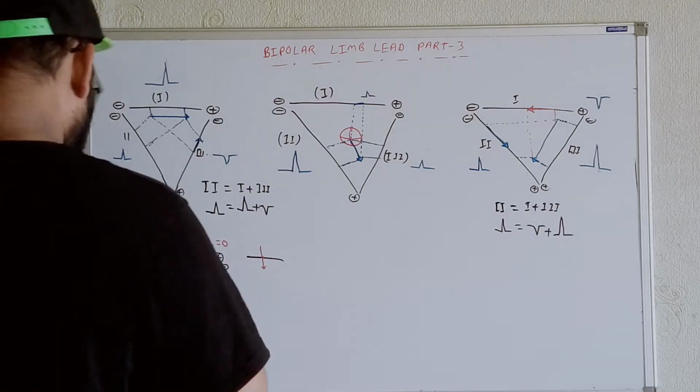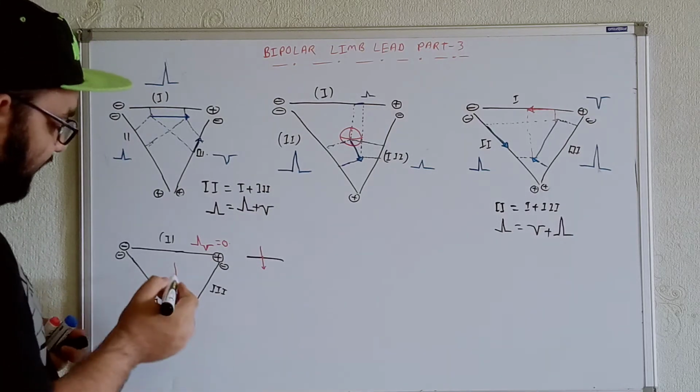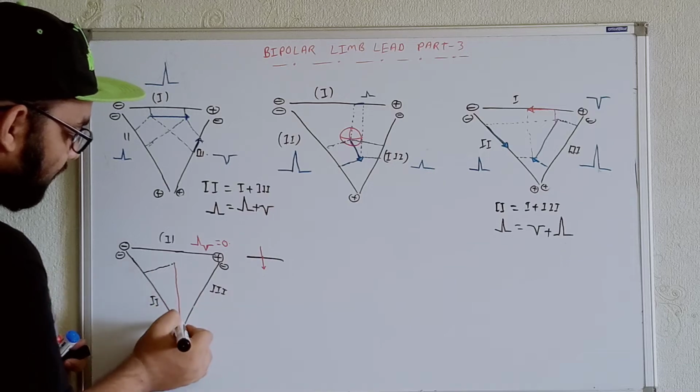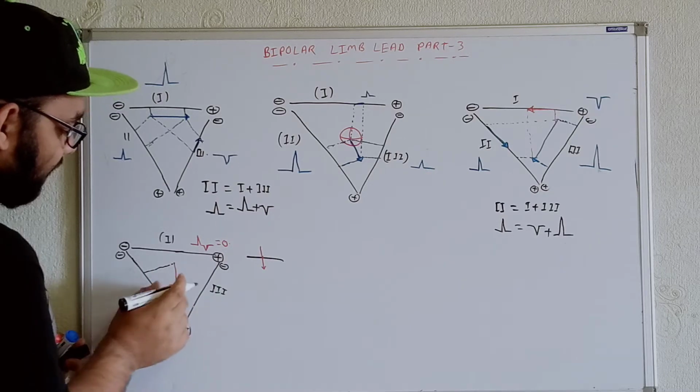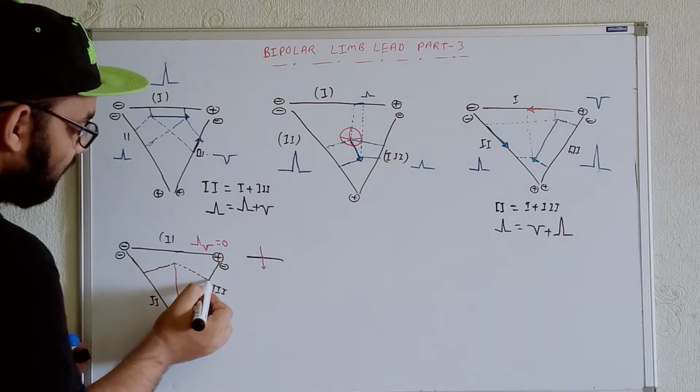Okay. Now try to understand from these two, as it's perpendicular, for lead number 2 and lead number 3 you will get the same portions over here. So whatever value we get for lead number 2, the same we'll get for lead number 3.